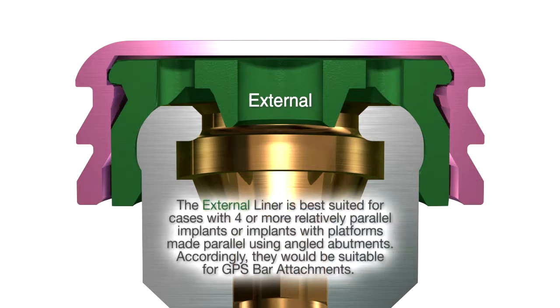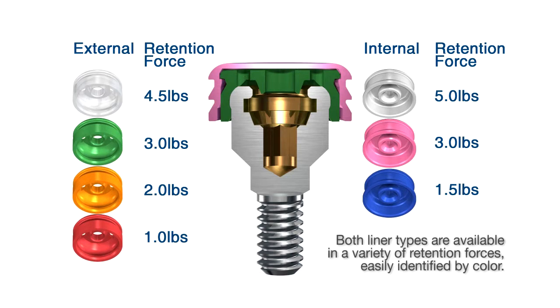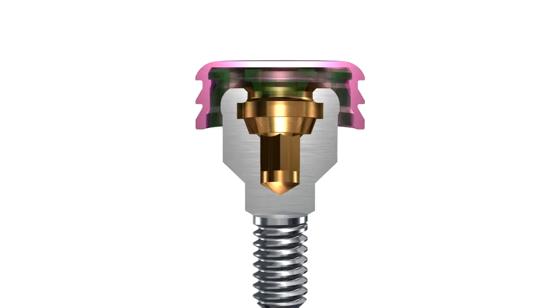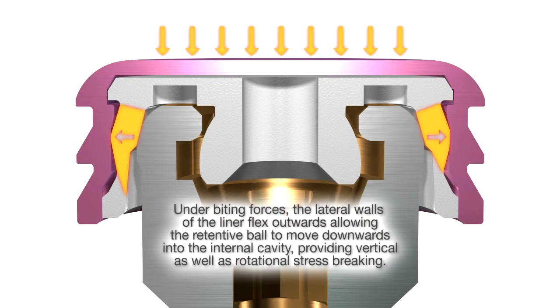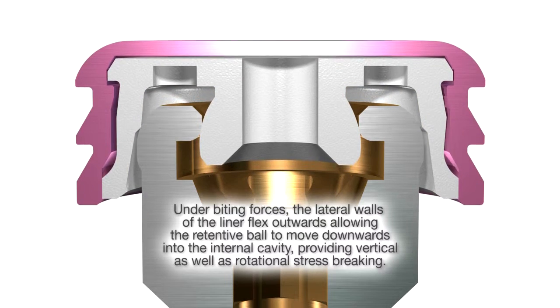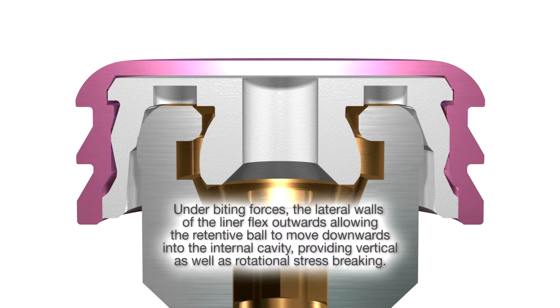Here's the external one, which is what we use on bar overdentures now, where we're sure to get these parallel and where we don't need vertical stress breaking. It will rotate. So we've got the external and we have the internal. Attachments usually come with the 5-pound retentive one. And you can see how this moves out of the way and allows the ball to move up and down. And rotate.